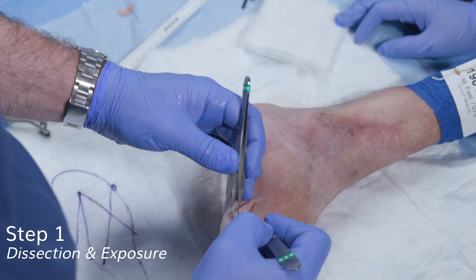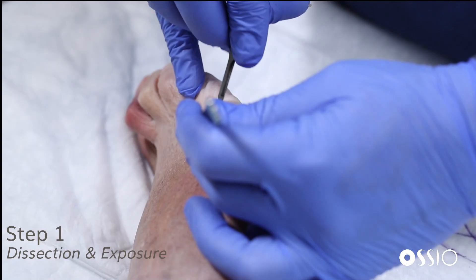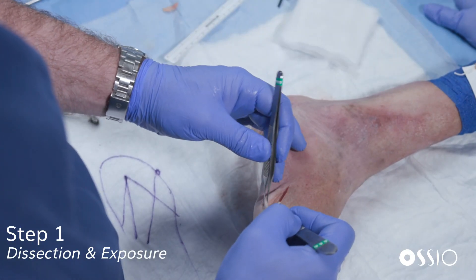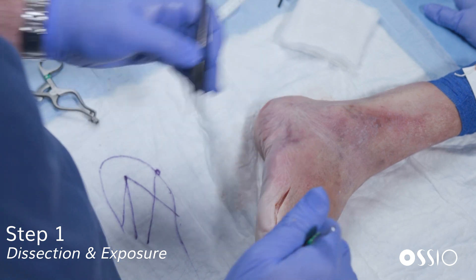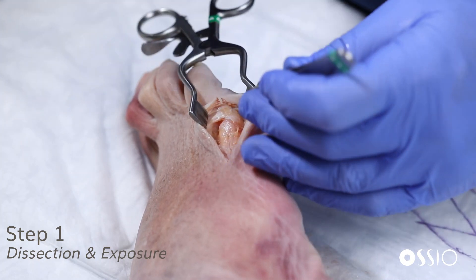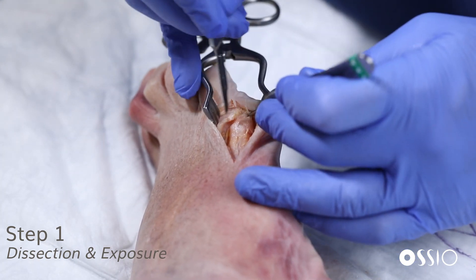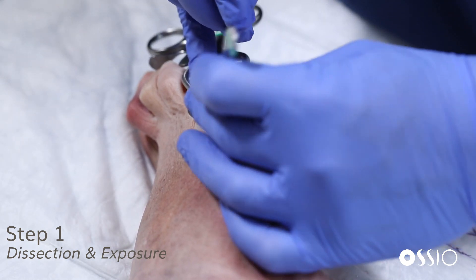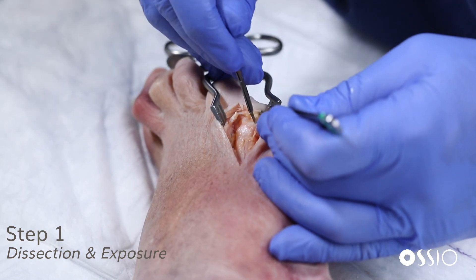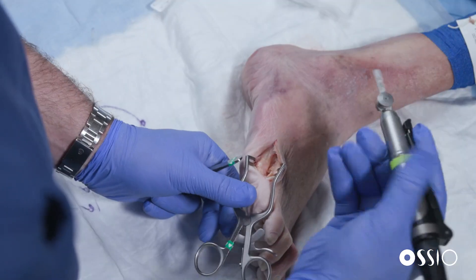We'll make this approach from a dorsolateral approach of the fifth metatarsal, taking care to adequately reflect the soft tissue envelope protecting the cutaneous nerves in the area. A self-retainer is placed, and we make a full thickness incision through the capsule at the level of the MTP joint. We carefully reflect any adhesions plantarly at the plantar condyles, achieving good dissection and exposure for our osteotomy.